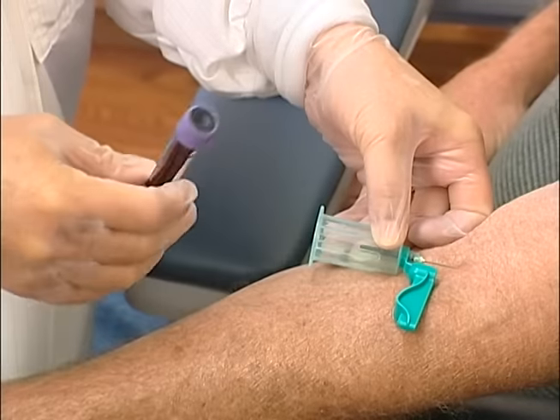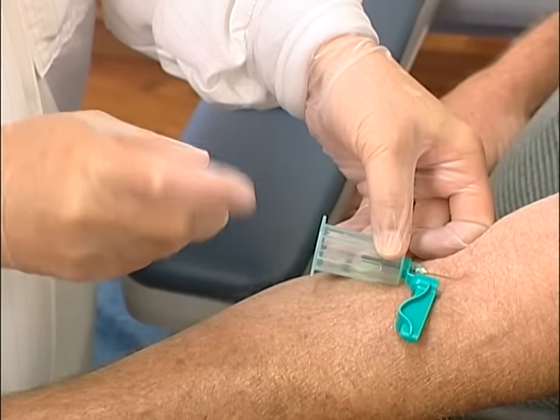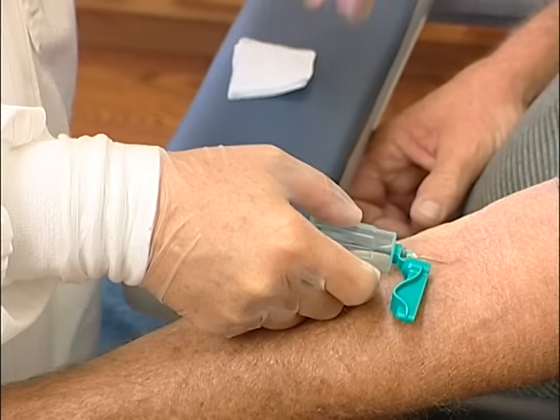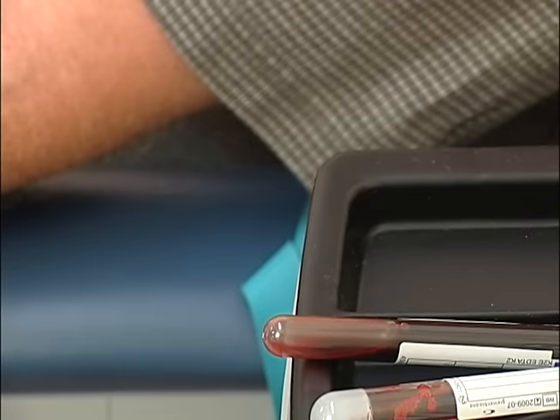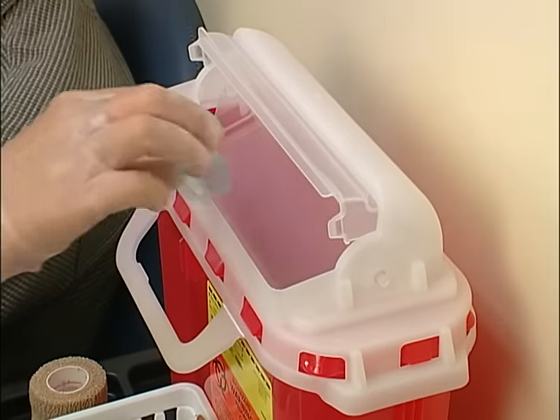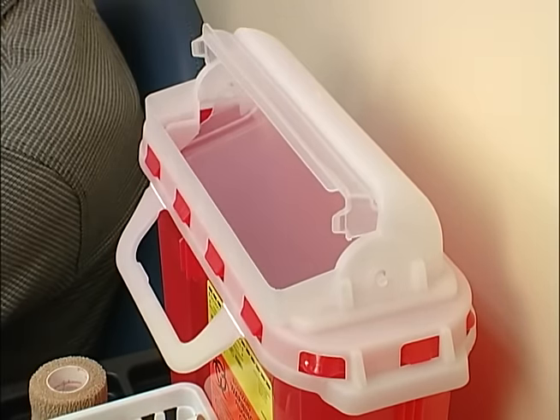When all tubes have been filled, have the patient open his fist, release the tourniquet if it has not already been released, and place a clean gauze pad over the insertion site. Remove the needle and apply pressure. If the safety feature is not triggered passively, activate it immediately. Discard the collection device according to OSHA guidelines and your facility's policy.